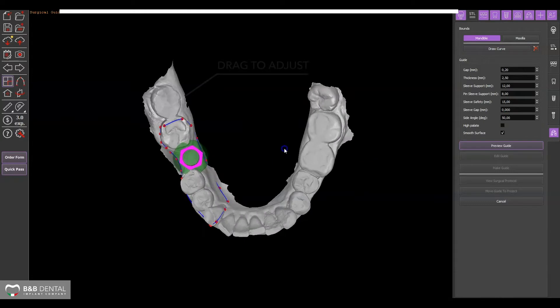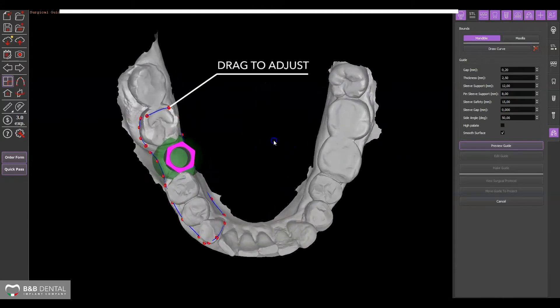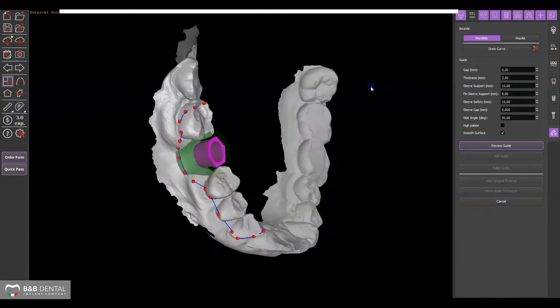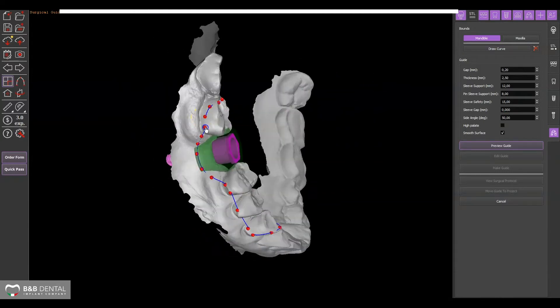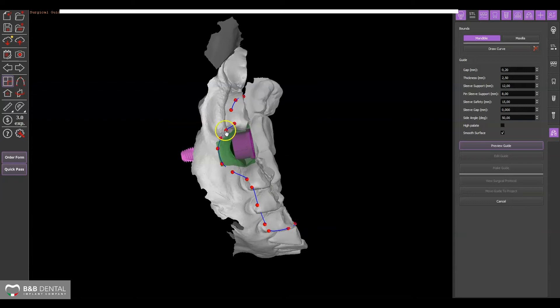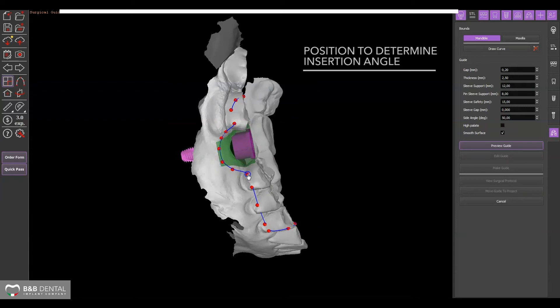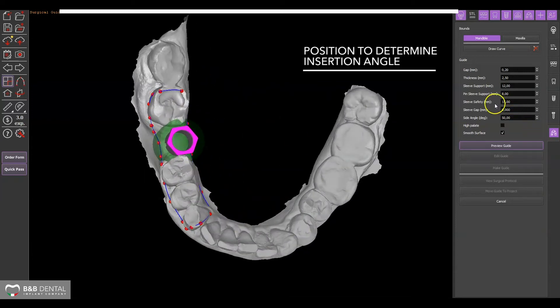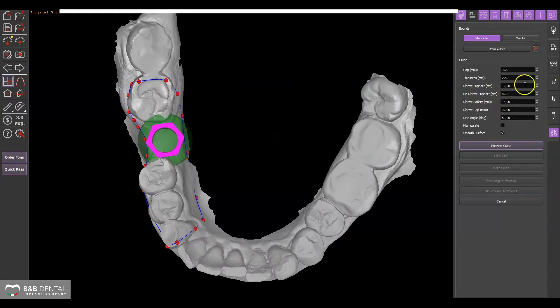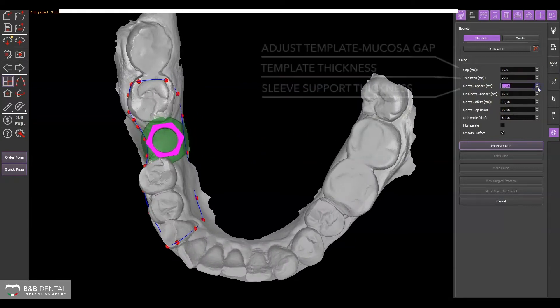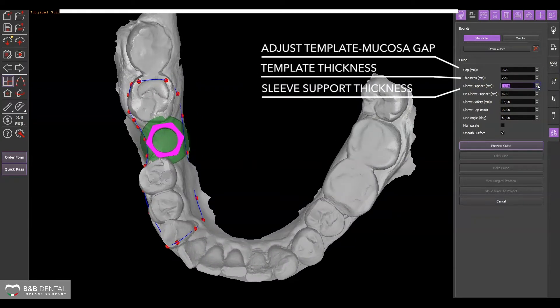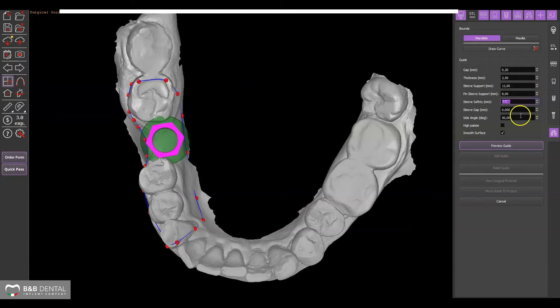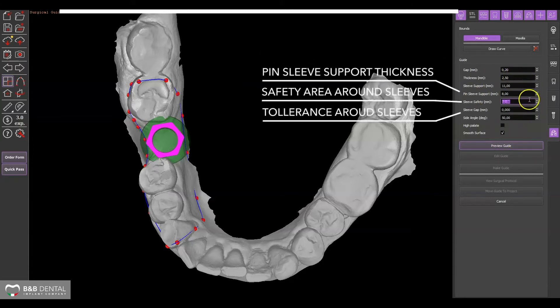If necessary, move the markers to improve the shape of the template and use the parameters on the side panel to adjust the template creation options, such as the gap between the mucosa and the template itself, the thicknesses in all areas and around the sleeves, or to set the tolerance parameters in accordance with the features of your printer to provide the correct fitting of the sleeves.